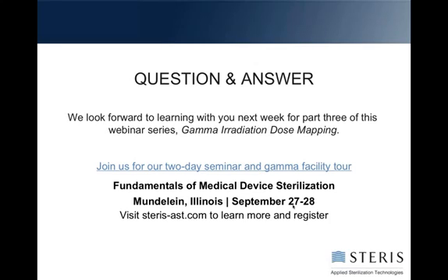Plus, the more information you have on the types of organisms present in your product over time gives you data to support any problems later, but also gives you some of that data you need if you ever want to reduce your audit frequency.